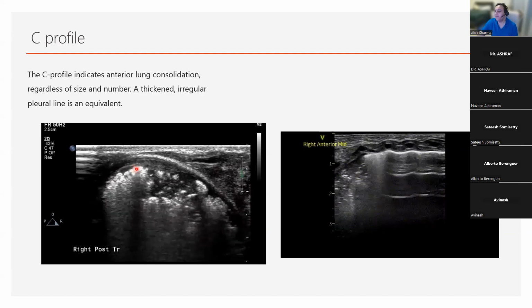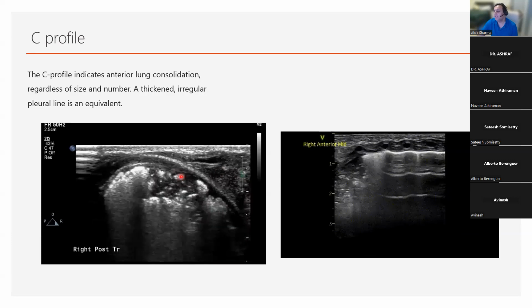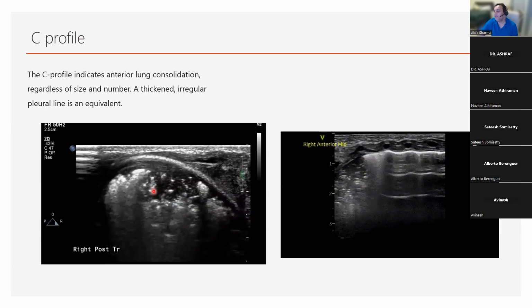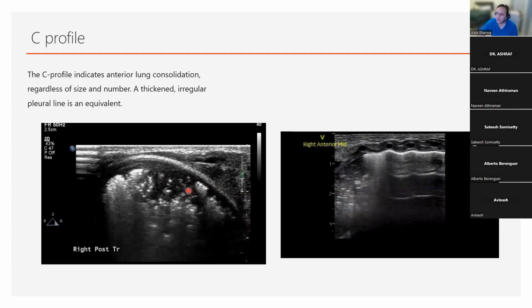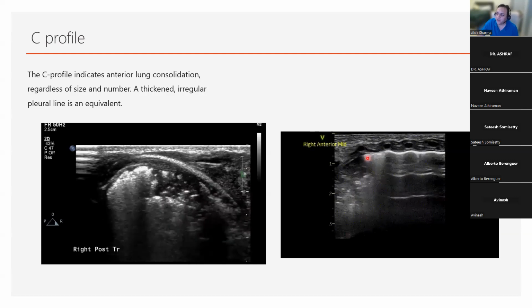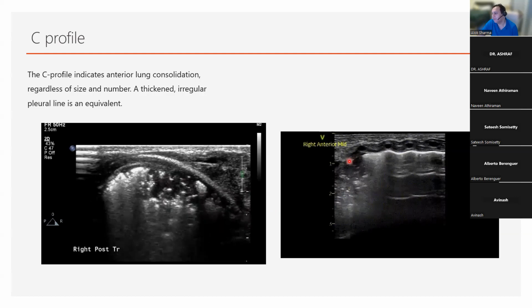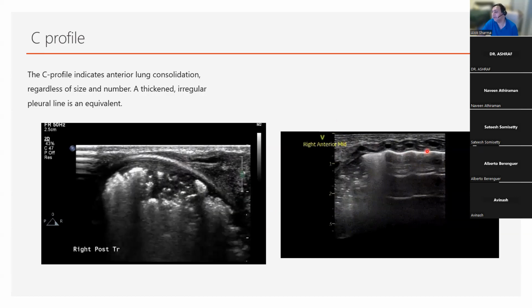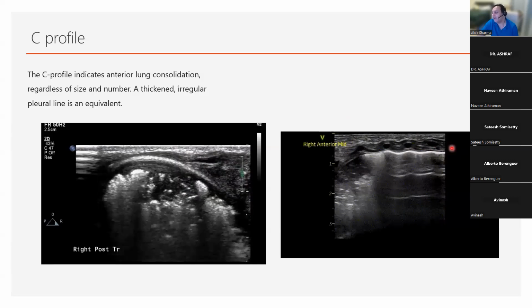So here you can see a pleural margin. You can see a pleural margin. You can't see the pleural margin over here. So there's an element of atelectasis over here, but really it's very irregular. Because of this irregularity, I'd be very worried there's a pneumonic consolidation over here. Whereas on the right-hand side, I've got this really big upper zone. So this is right anterior mid that you can see over here. This is technically R1, and we're moving towards R2.